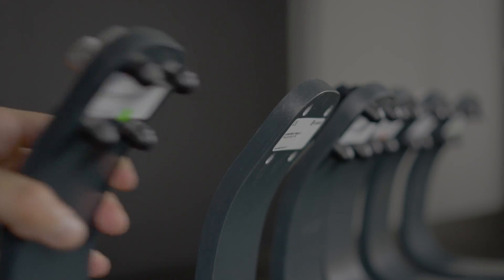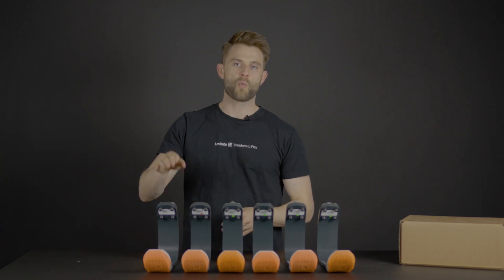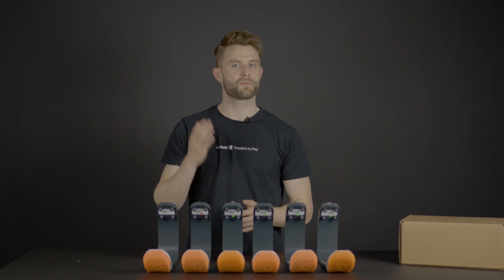In the checkout section, we ask you to supply your body weight. Depending on what you input, we will select one of the six stiffness categories that will fit your body the best.